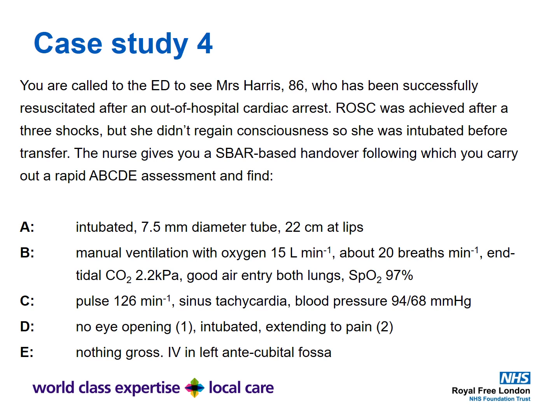So she's getting manually ventilated. So there's a potential for hyperinflation injury. 15 litres, 20 breaths per minute. Now remember, we want to try and get patients post-cardiac arrest into a normal physiological state. So is 20 breaths per minute the right thing to do or not? No. So she's being over-ventilated. So again, think about how that will appear on her blood gas.